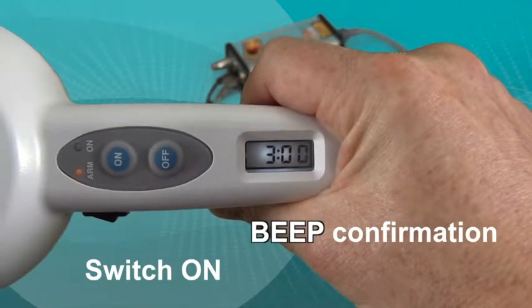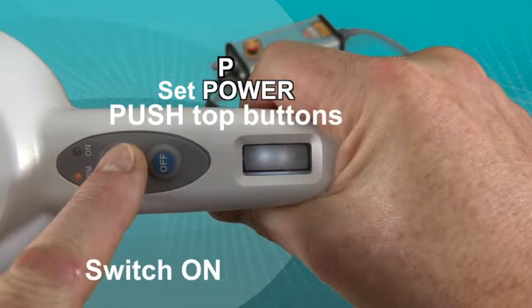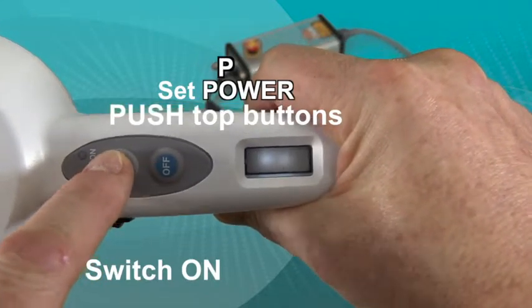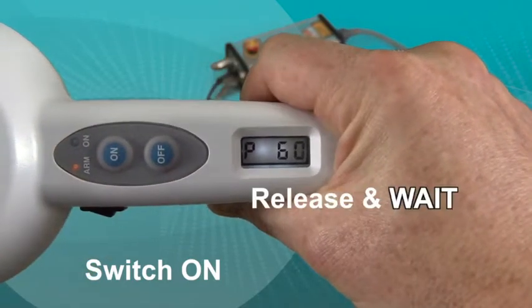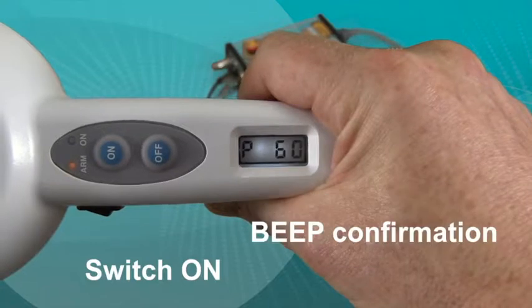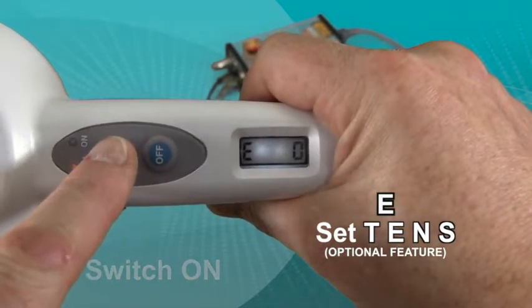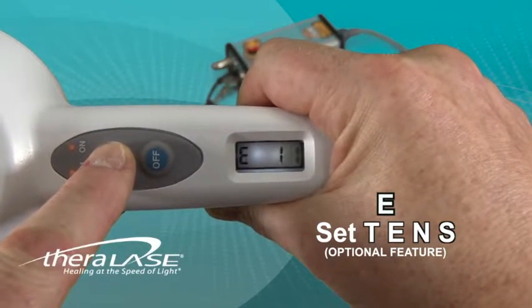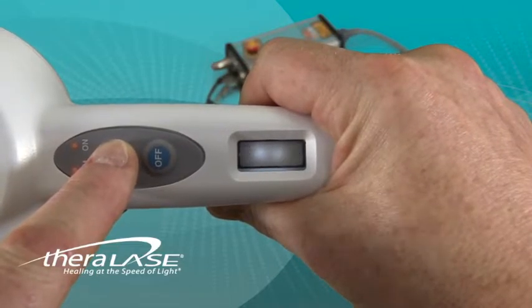Upon reaching the intended time, simply release the button, wait for the beep, and begin setting the power in the same manner. TLC-900 models equipped with TENS will have the TENS setting appear next. The E stands for Electrical. 75 is a common setting for TENS.